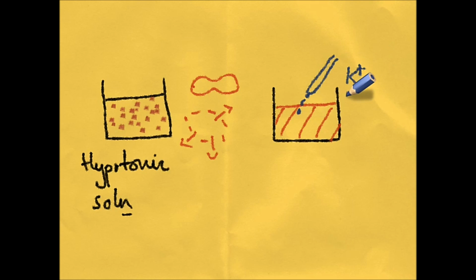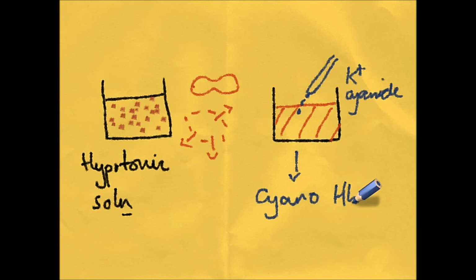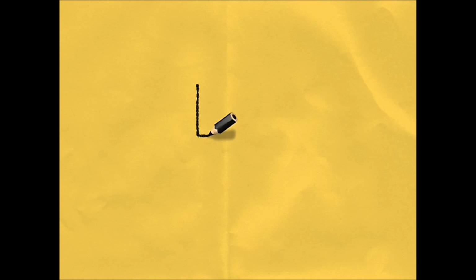And so to measure accurately the total amount of haemoglobin, we need to convert it to one form. The standard method for doing this involves converting it to cyanmethaemoglobin by the addition of potassium cyanide, though many analysers use other chemicals nowadays to convert the haemoglobin to a single form.